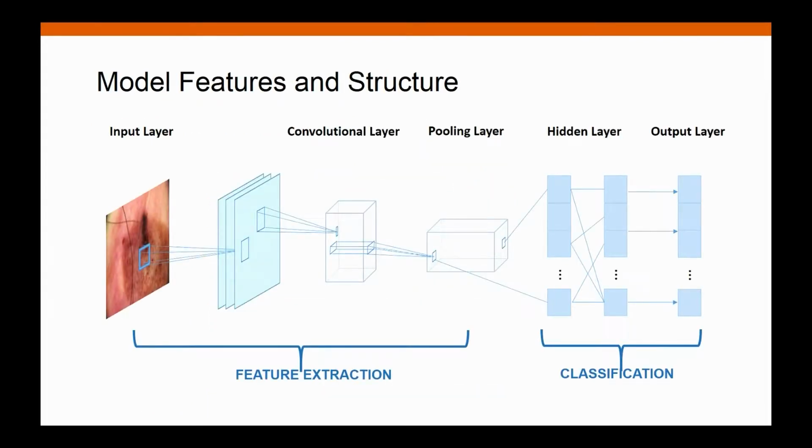And here I'm going to briefly introduce the model structure and features of our algorithm. The deep learning algorithm that we use is actually GoogleNet Inception version 3. Because our image set is not a large data set, it's actually pretty small, only thousands of images, no more than 5,000, so we just adjust the final layer.